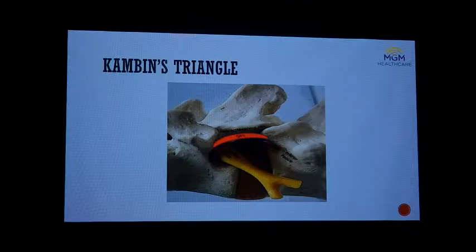This is what we need to understand. What is this transforaminal approach? The conventional approach is the interlaminar approach. Here you have to use an extraforaminal approach. We are coming from a far lateral approach away from the midline, approximately 12 to 15 centimeters from the midline. We are going between the two pedicles, and along the inferior pedicle we have the nerve root, the end plate on the lower side, and the ligamentum flavum and the disc anteriorly. That triangle is what we are going to utilize.